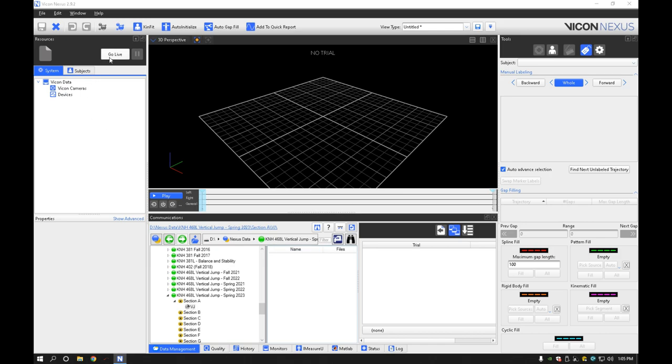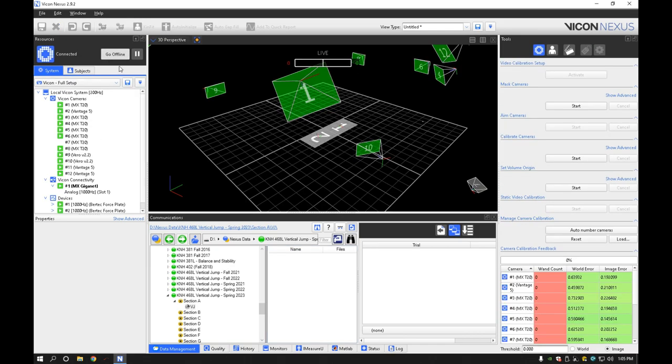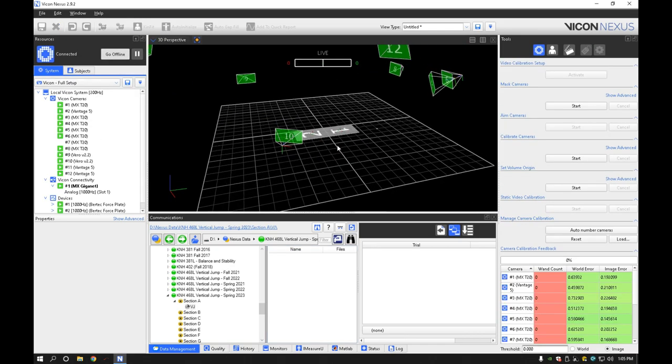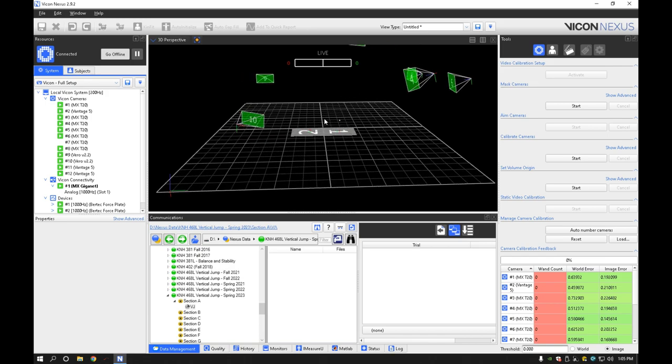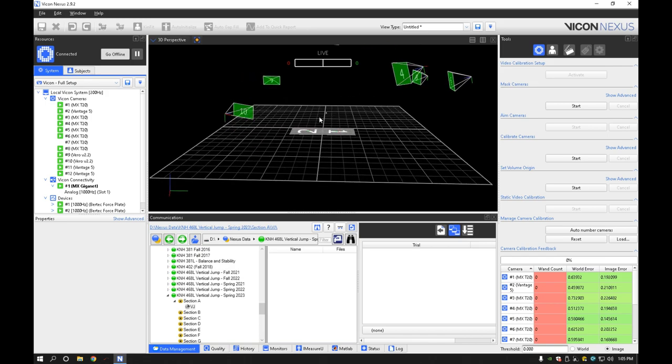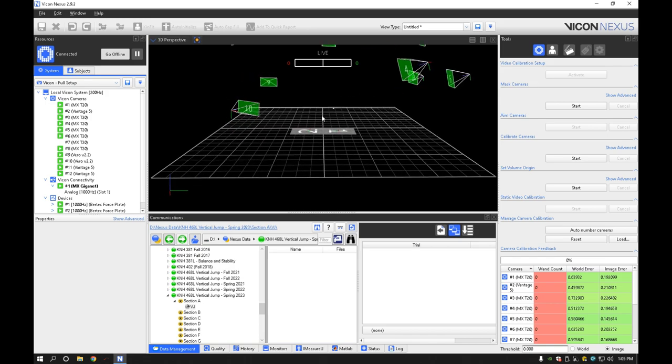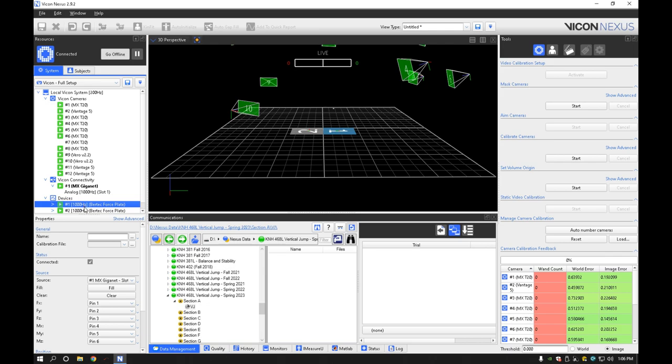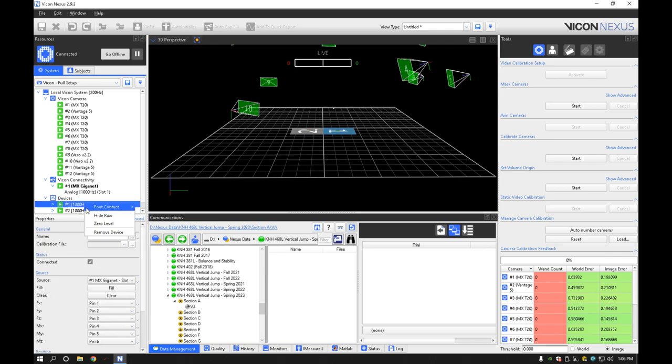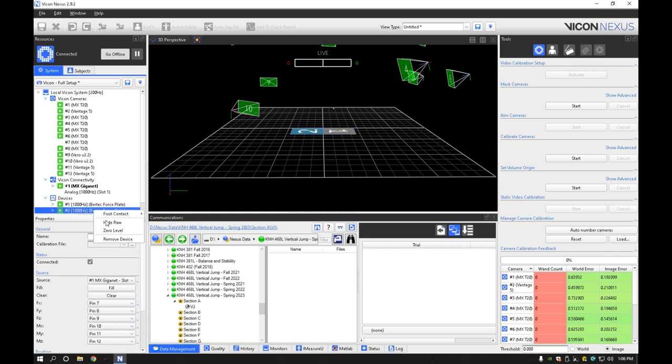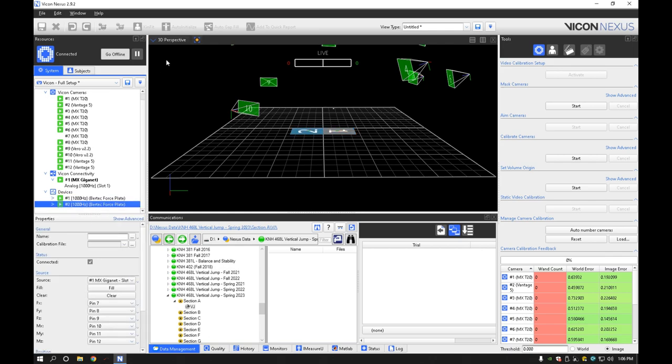So now we're going to go live. Alright, we can see our force plates here. We can also see the 3D perspective. This is basically from where I'm sitting right now in the lab. We don't care too much about the cameras because all we're doing right now is force plate data capture. So I'm going to go ahead and select both the force plates. We're not going to remove, we're going to zero level them so that they read zero.